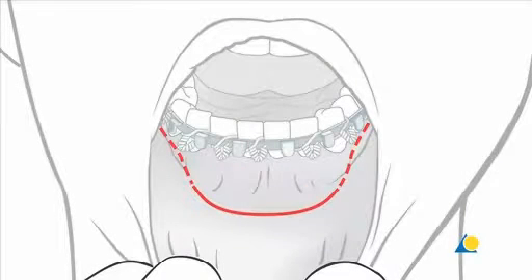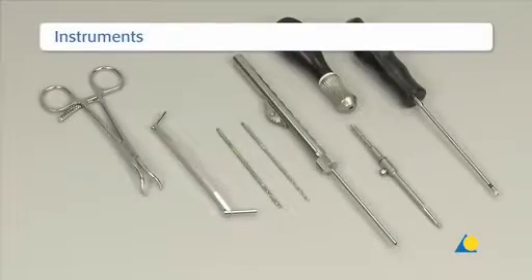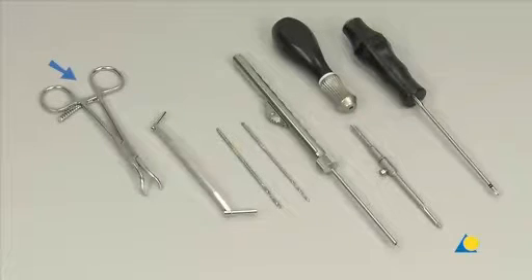The standard approach for fractures of the symphysial region is intraoral. The instruments needed are: the reduction forceps with points, the 2.4/1.8 double drill guide, the 2.4 and 1.8mm drill bits, the depth gauge, the countersink with handle, and a self-holding screwdriver.